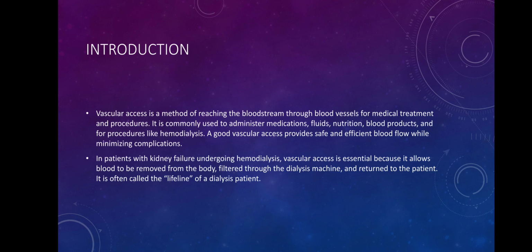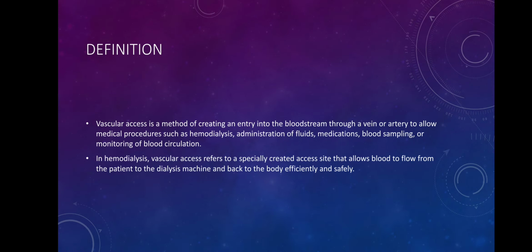In patients with kidney failure undergoing hemodialysis, vascular access is essential because it allows the blood to be removed from the body. It filters through the dialysis machine and returns to the patient. It is often called a lifeline of the dialysis patient. Next, definition of vascular access.